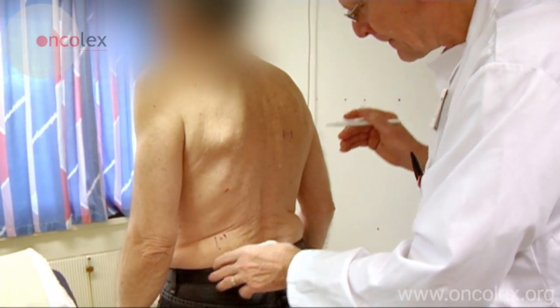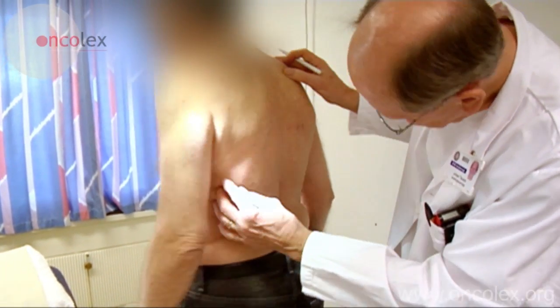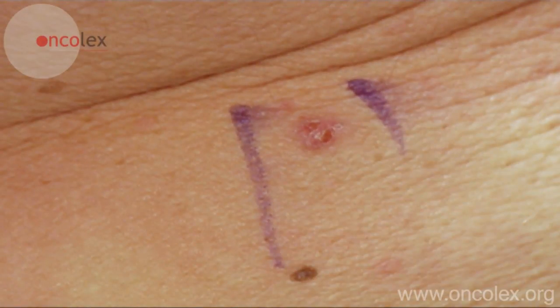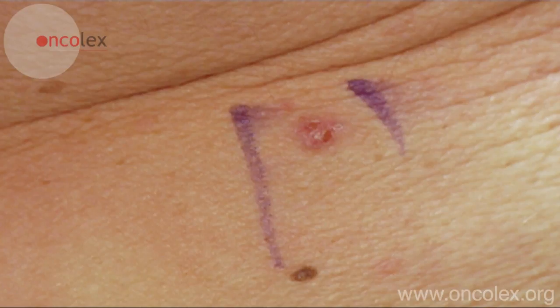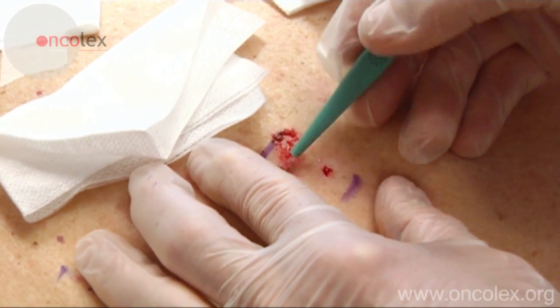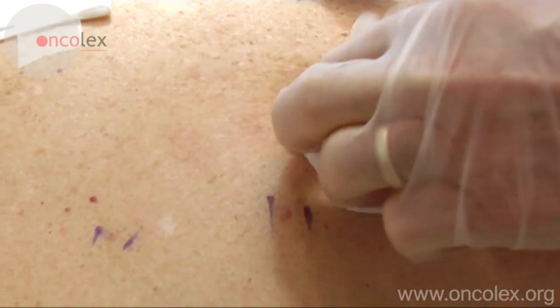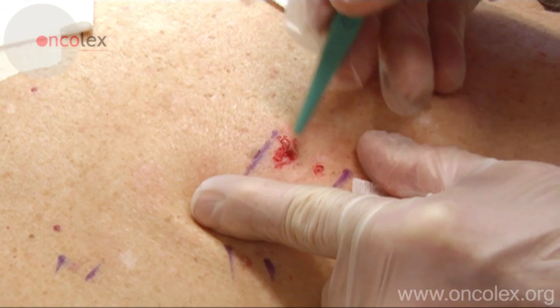This is a video of photodynamic therapy on a patient with basal cell carcinoma. Photodynamic therapy is a two-step procedure. First, the lesion is scraped with a curette and covered with a cream containing the photosensitizing agent methyl aminolevulinate. The lesion is then exposed to red light.